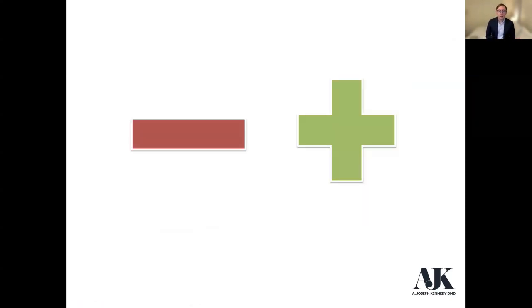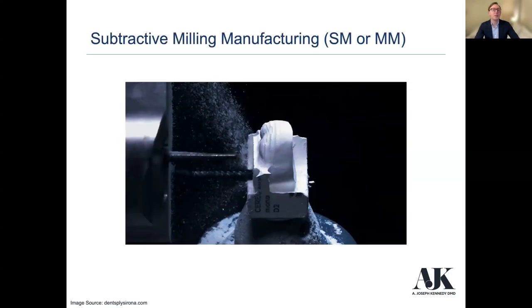So this isn't a math lecture at all, but we think about the current ways that we manufacture dental restorations. The predominant one is the subtractive method. And what do I mean by that? We think of subtractive milling. Some of you may have milling units in your office. You can do quite a bit with them.